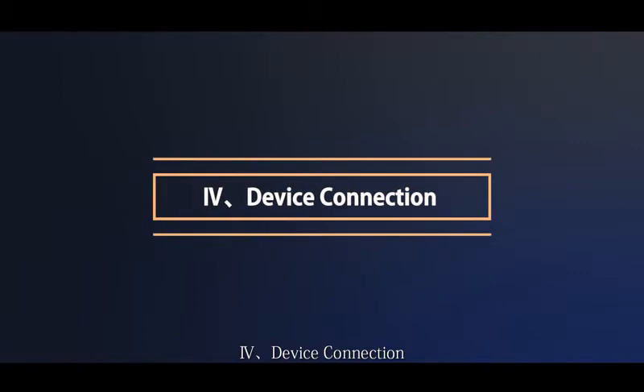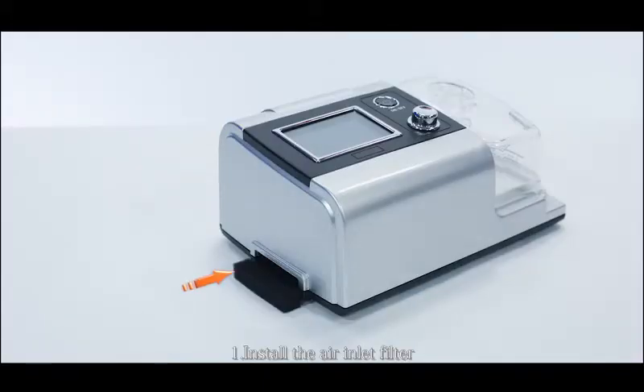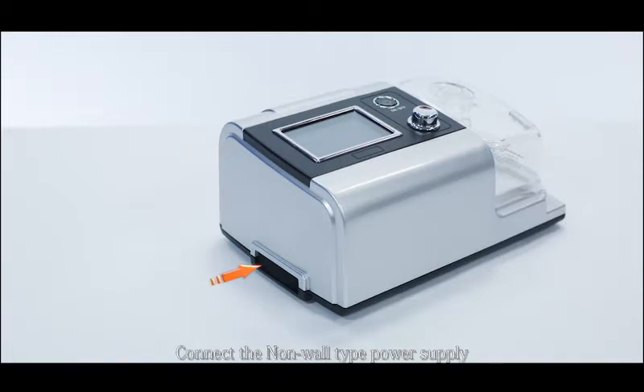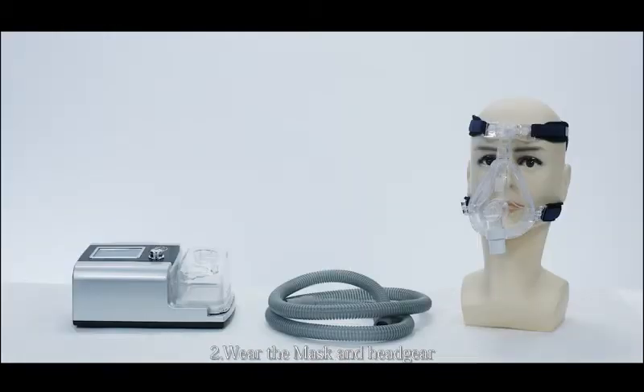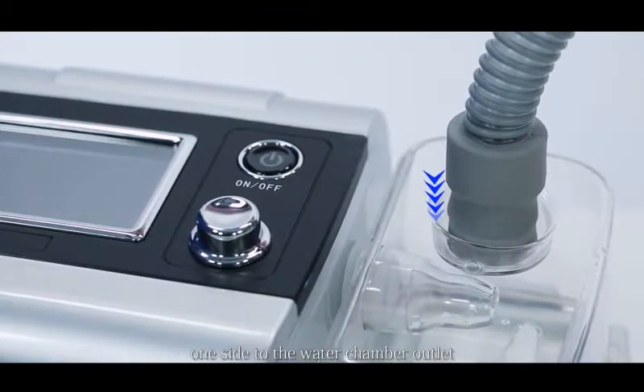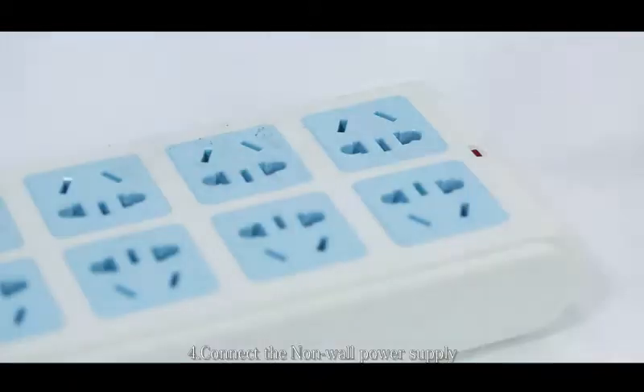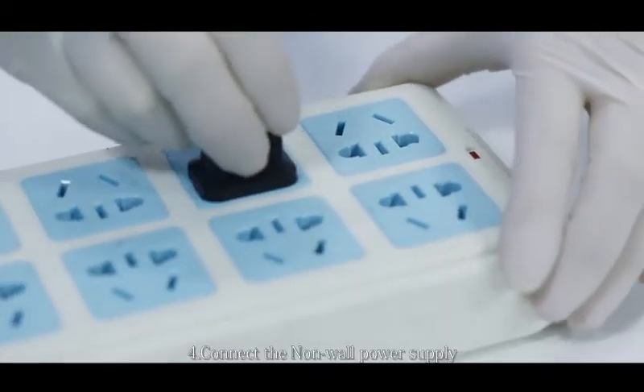Device connection. Step 1: Install the air inlet filter. Step 2: Wear the mask and headgear. Step 3: Connect the tube — one side to the water chamber outlet and the other side to the mask inlet. Step 4: Connect the power supply.